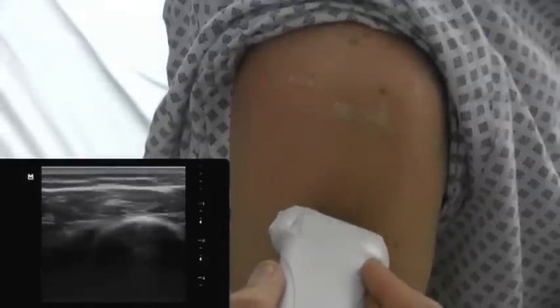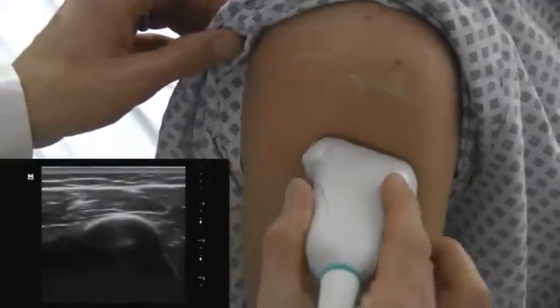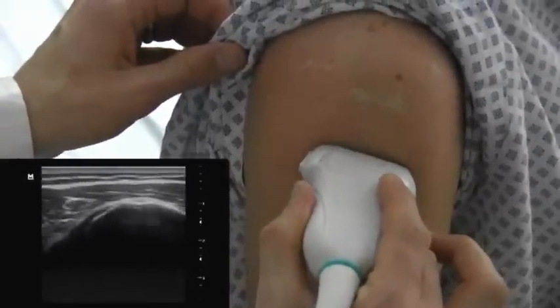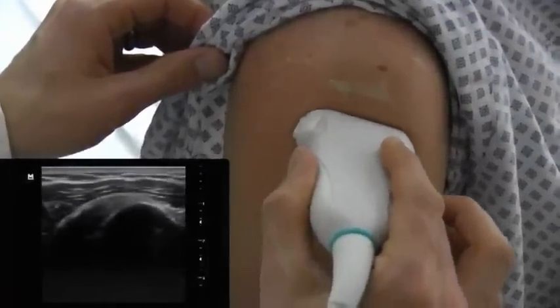We're going to ultrasound the shoulder for dislocation. This can be used both to assess for reduction after reduction attempts, or to just diagnose the shoulder dislocation.